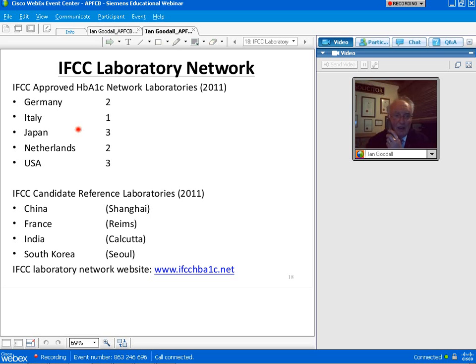the old networks, Japan, Sweden, and the United States, are all arbitrary based on different HPLC ion exchange methods. And HbA1c is a peak on a chromatogram. And due to interferences, all these methods define their own values, and they're different for each designated comparison method. So there's a whole lot of problems with them, which I'll just run through the ones with the American system. So the numbers are really only relative, and they're not true hemoglobin A1C values. Yes, so I've been through all that.